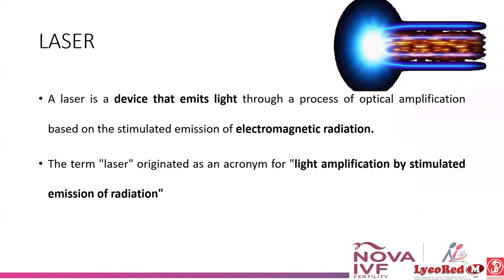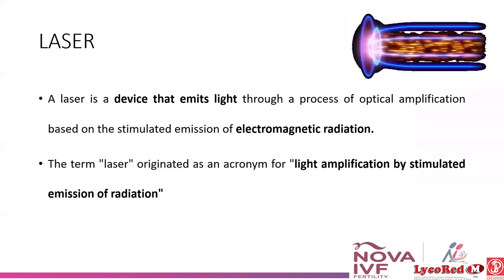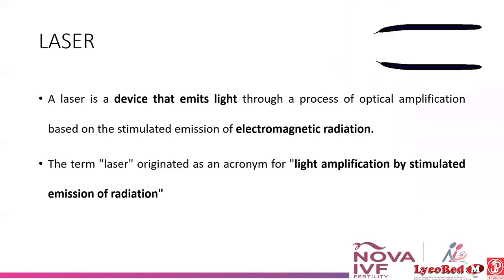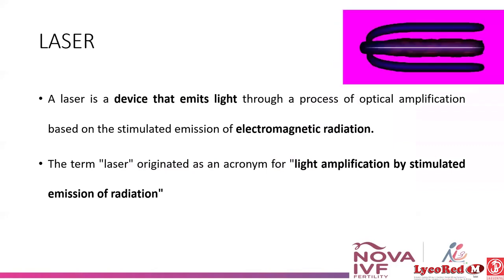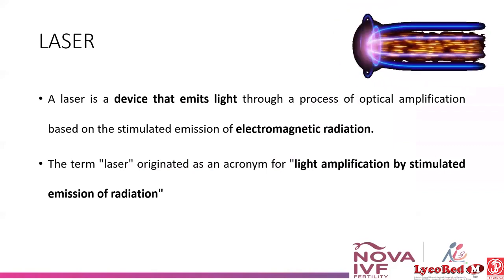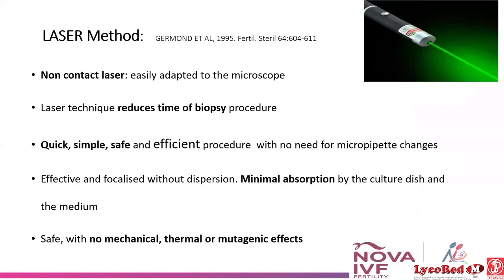Coming to the laser, right now we all are using the laser. A laser is a device that emits light through a process of optical amplification based on the stimulated emission of electromagnetic radiation. Simply, laser means light amplification by stimulated emission of radiation. It is a non-contact laser, reduces the time of biopsy, and is quick, simple and safe. There is lots of literature available that this laser is not going to harm our embryo. It is very simple and safe, because there is very minimal absorption by the culture dish and the medium.